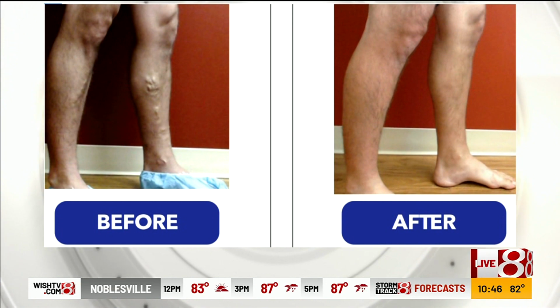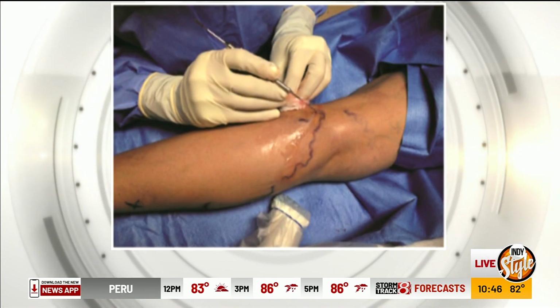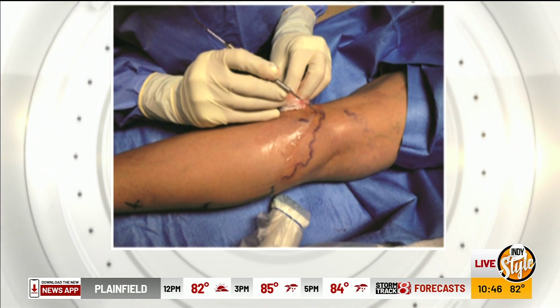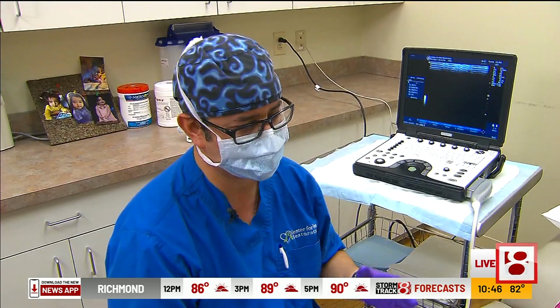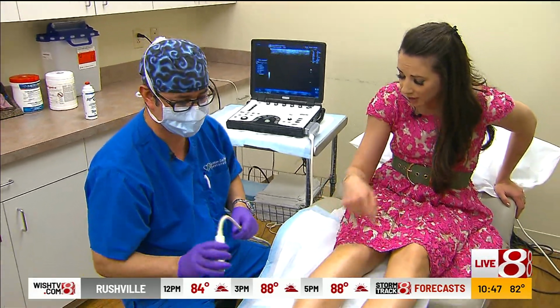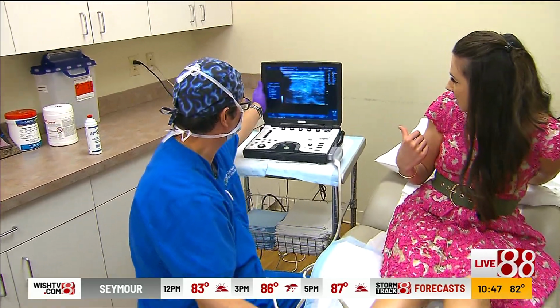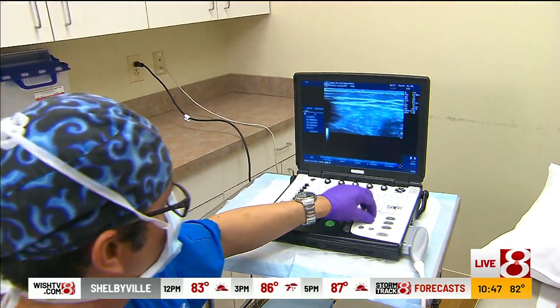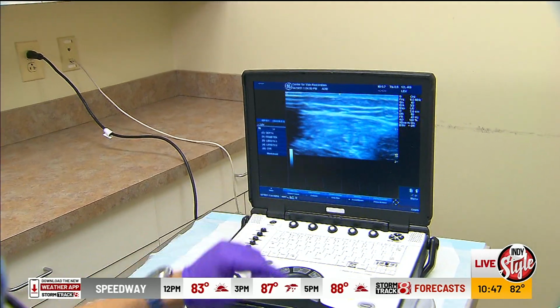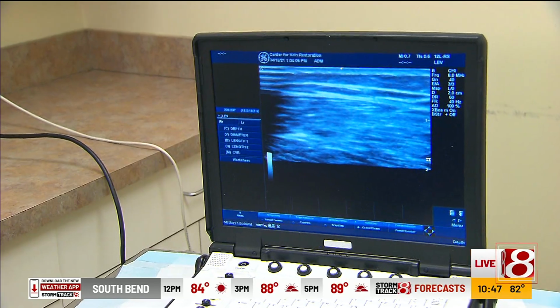Absolutely. In general, how do a lot of your patients feel after they get a procedure done? I'm sure medically they feel better, but it looks better too, right? And if you look better, you feel better? Right. So we try to give the full package treatment, not just make the legs feel better, but also look better as well. I want to see one more scan, if we're able to put a little bit of gel right over here and just see what that might look like. Just as we wrap this up, it's really interesting to me, it really shows you what you need to look for, what might be hidden from the naked eye. Right. So these small veins are the ones that are feeding into this guy here. So really not too much. They're very small in diameter. Okay, that's good to know.